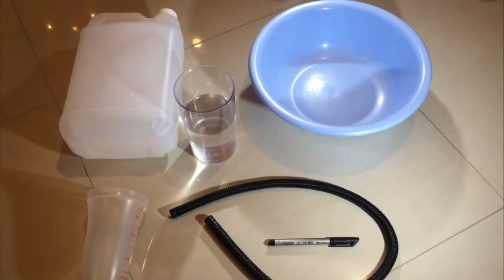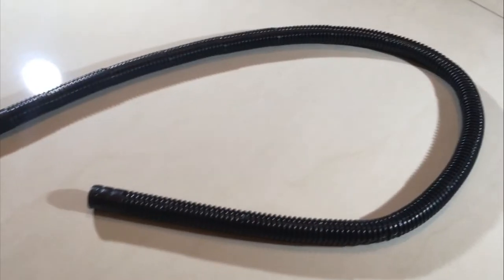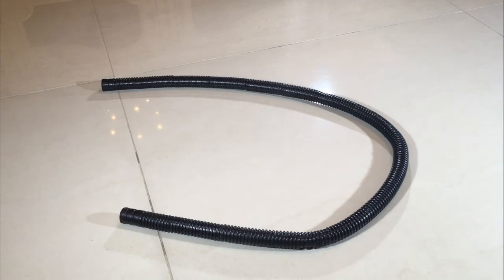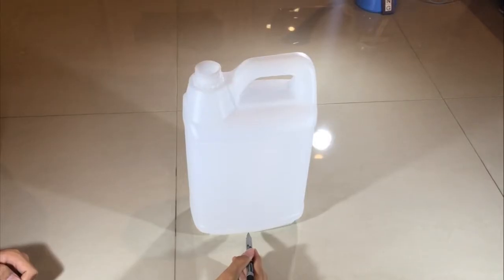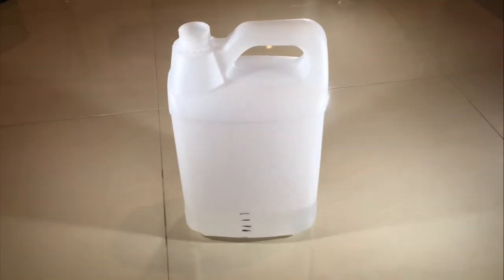The materials you will need are a water gallon, container, plastic tube, water, marker, and a measuring cup. First, make sure the plastic tube is clean and sterile. Second, fill half of the container with water. Third, mark the water gallon with the accommodated measurements with a difference of 250 milliliters each. 4. Fill the water gallon all the way with water.